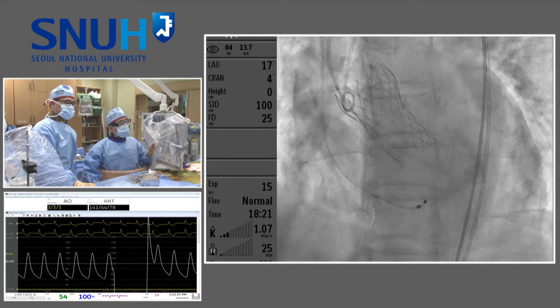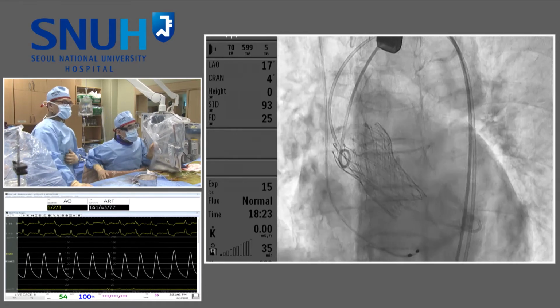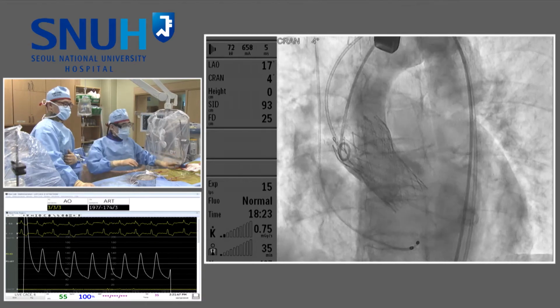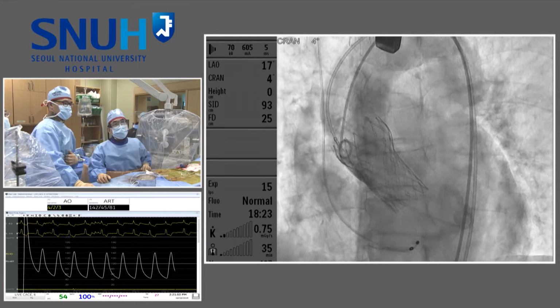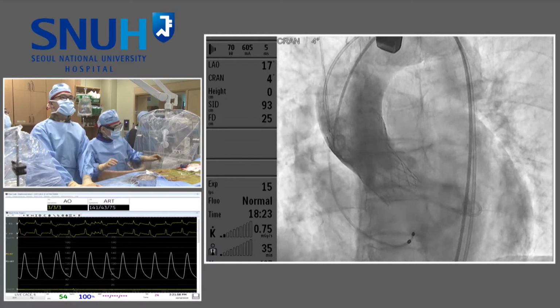Okay, stop. Anyone in the panel want to give their experience, opinion? Sure. I would like to just wait for 1 or 2 days to see whether the final ECG can change into better. Otherwise, maybe we need to consider pacemaker implantation.